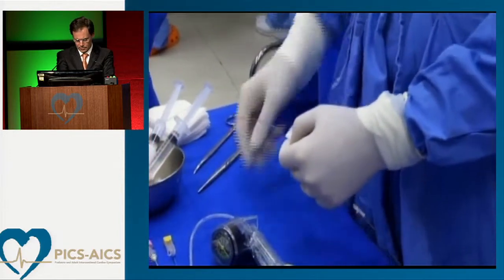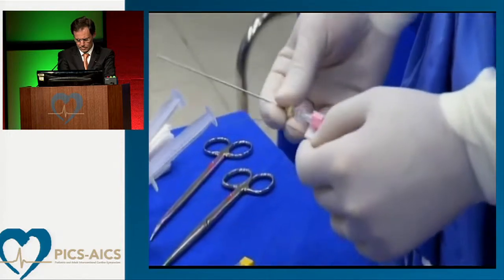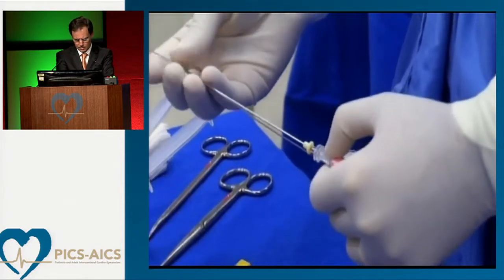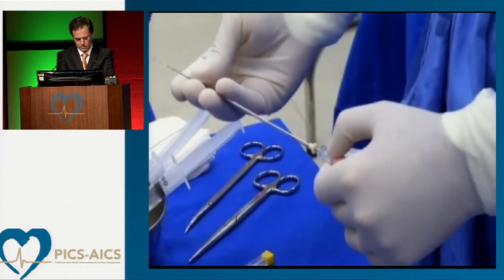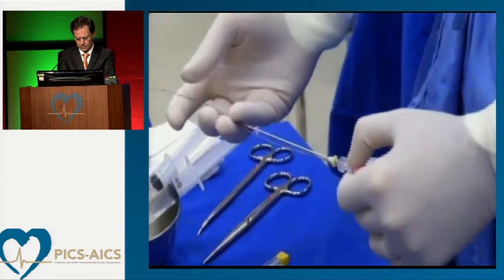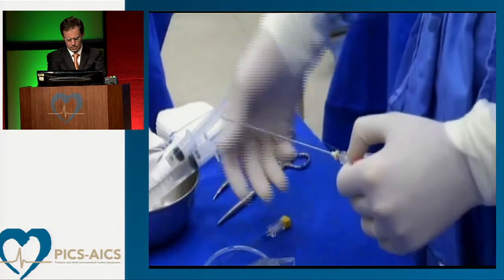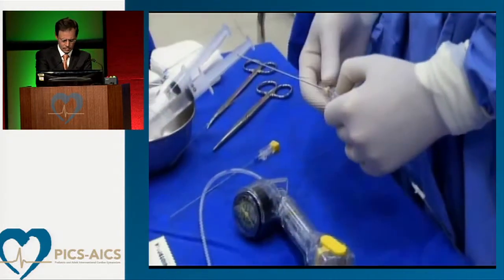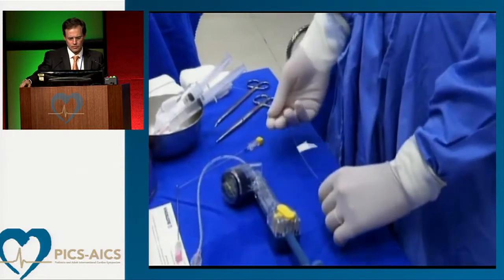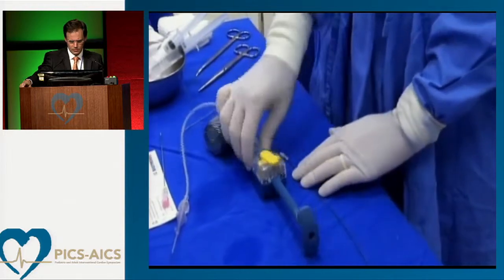And this tape here marks the tip, the hub of the needle. So doing that, I know that the balloon is going to be out of the tip of the needle, right? So when we see the wire in the ascending aorta, we just put up the balloon. We inflate the balloon here. So this is the setup. There's not much time to do all these things inside, so we leave everything ready to go.